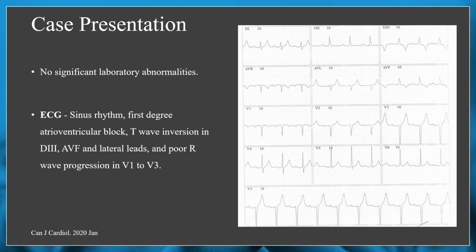Yes, it's an interesting ECG. And as we saw in the other case series about the MPNSTs, about these kinds of tumor, it's a very aggressive and invasive tumor. So I think by the electrocardiogram we can think about that, right?